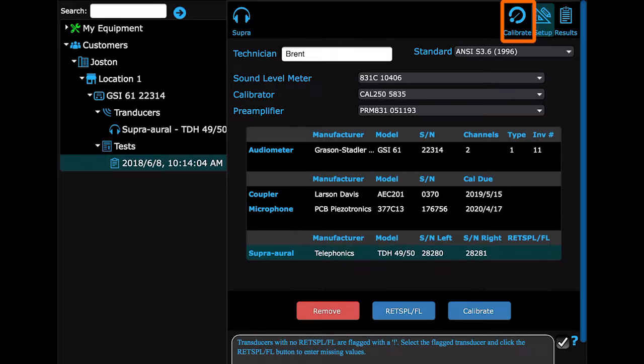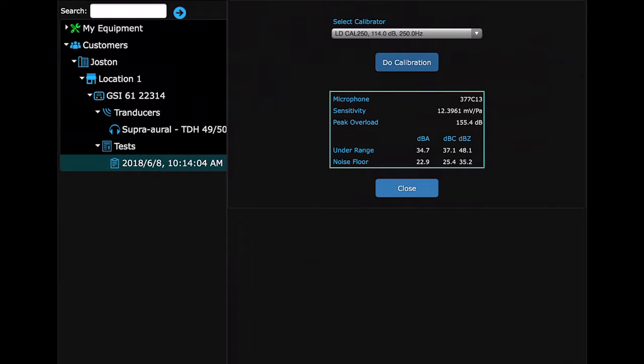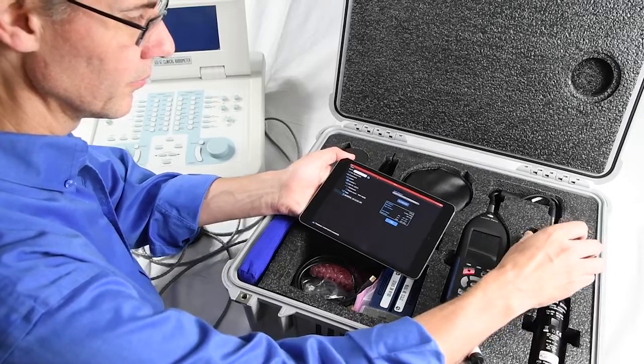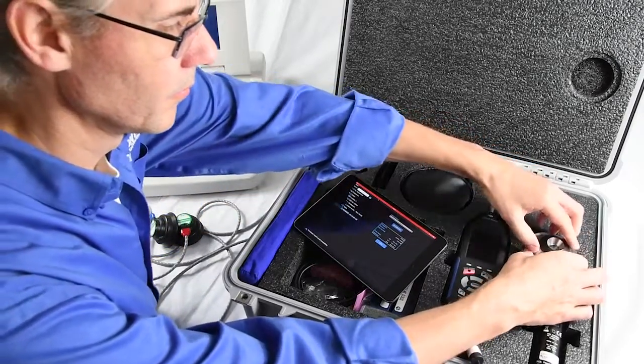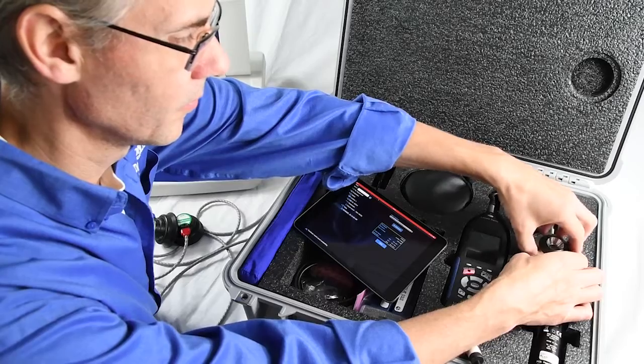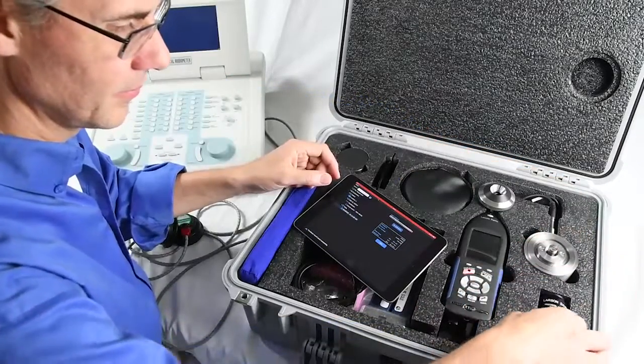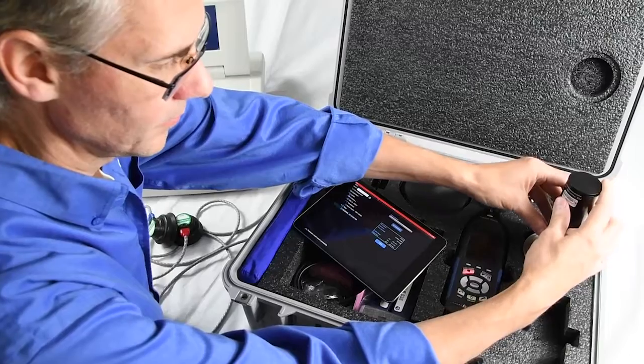Navigate to the Calibrate icon in the top. Remove the top of your coupler to expose the microphone. Make sure that you don't remove the grid cap off of the microphone. If you do, gently screw it back on. Place the calibrator over the microphone.